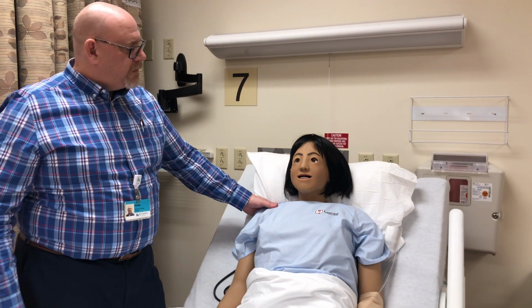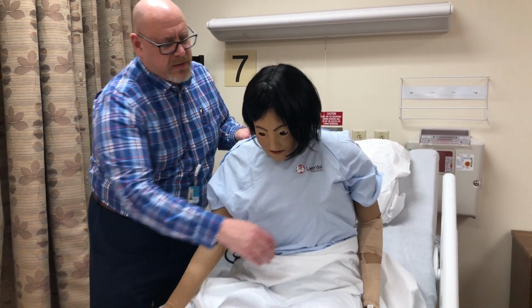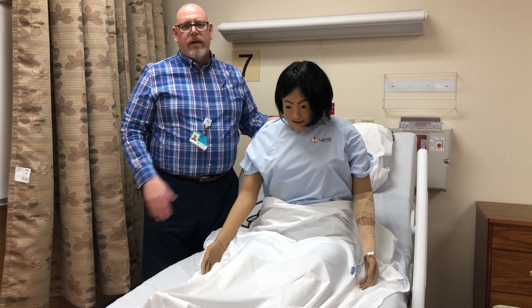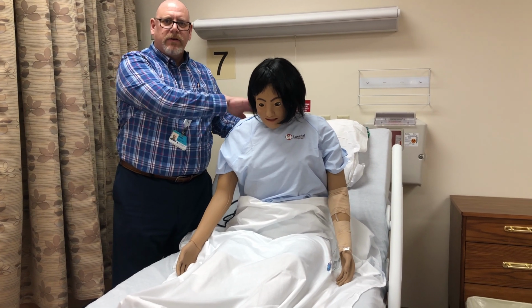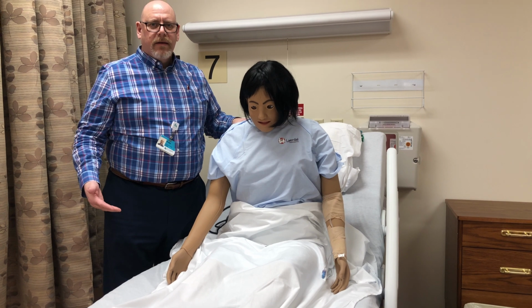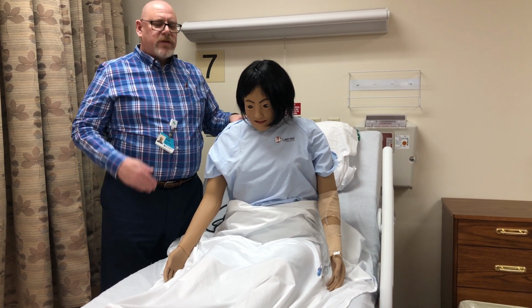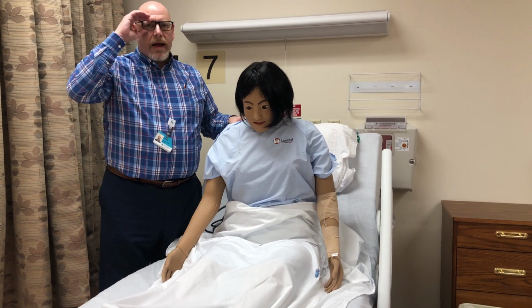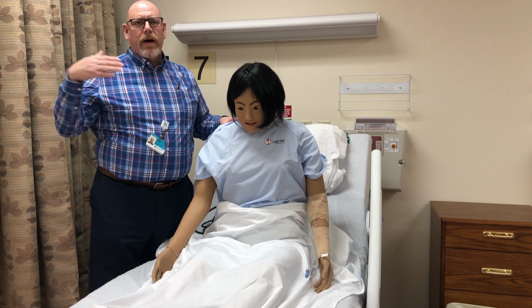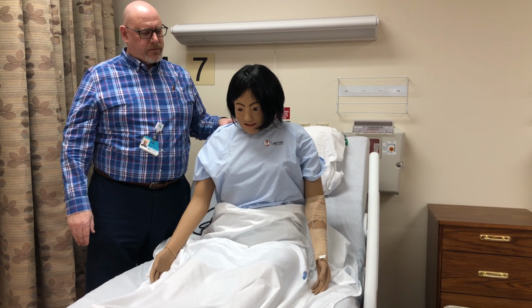Things that Annie does. Annie can sit up on her own. We can sit her in a sitting position so that our students can evaluate her back, listen to her lung sounds on the back. She can sit on the edge of the bed, so that's an important tool when you're assessing a patient. And this way the nursing students can practice a good quality nursing assessment before they go out into the field to do their clinicals and then to later work as a nurse.